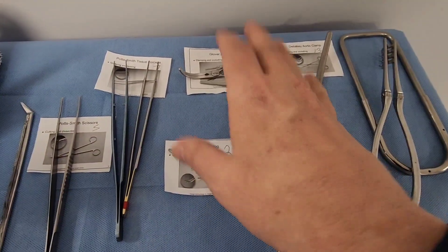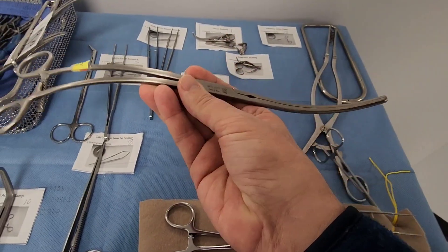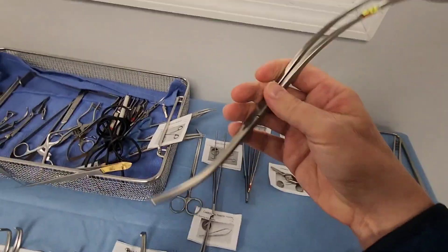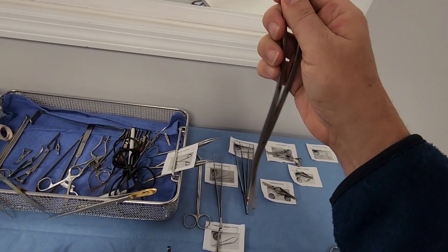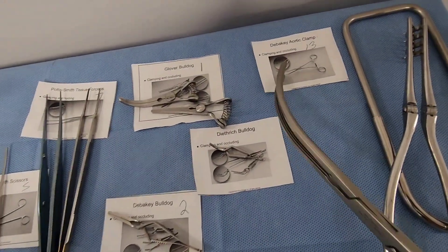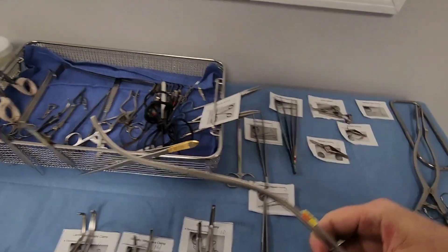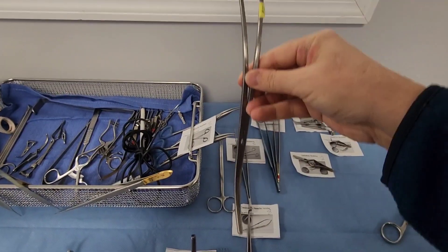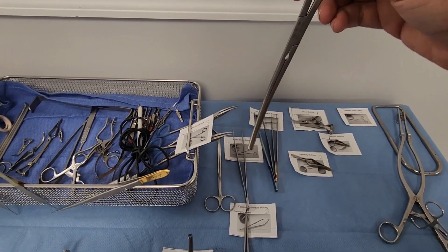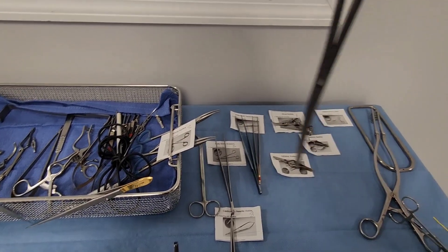In a true emergency — if someone nicks the aorta — you grab the DeBakey aortic clamp. It's a large clamp designed to go right down into the belly. There's something called the Mattox maneuver where you move the colon to gain access to the aorta. You clamp it off to stop the bleed so you can get in and figure out how to fix it.